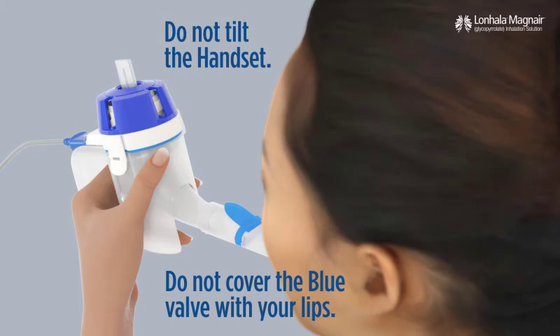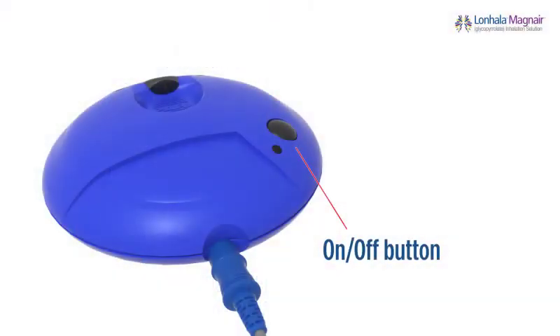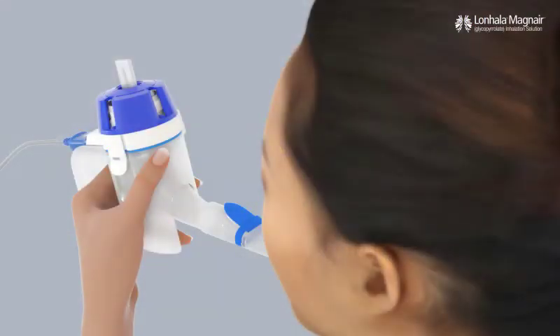Now you're ready to use the Magnair nebulizer system. Sit in an upright and relaxed position. Hold the handset and place the mouthpiece in your mouth, sealing your lips around it. Be careful not to tilt the handset because your medicine could leak and you will not get your full treatment. Also, do not cover the blue valve with your lips. Turn on the controller by pressing the on-off button. The green LED light will turn on and you will hear a single beep that indicates your Magnair is functioning properly. Breathe in and out normally through the mouthpiece. Do not breathe through your nose and do not cover the blue valve with your lips. The blue valve should lift to let some mist escape when you breathe out.